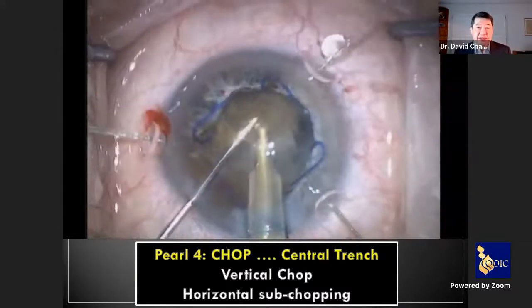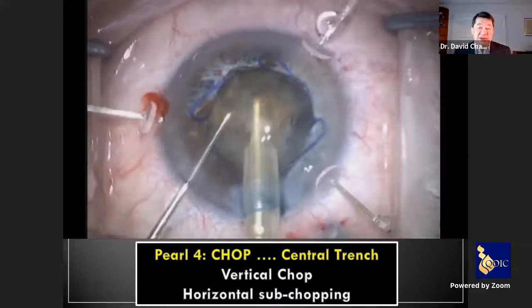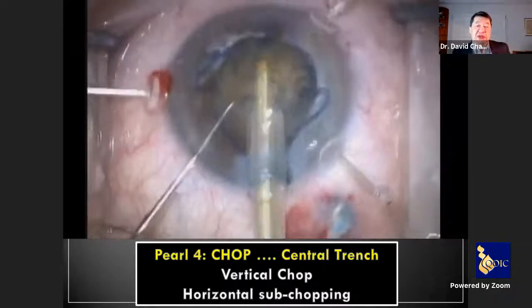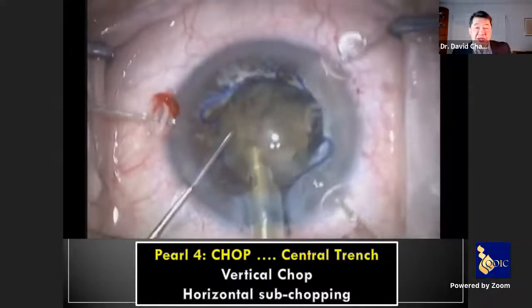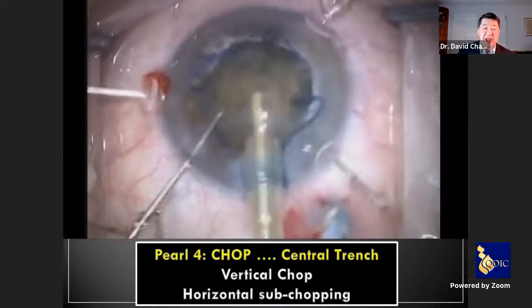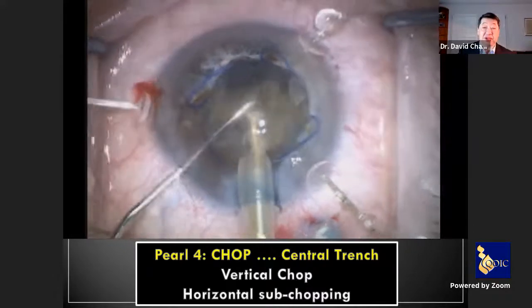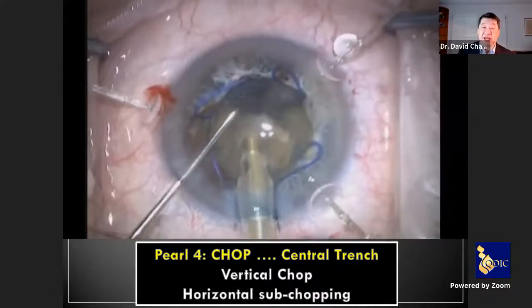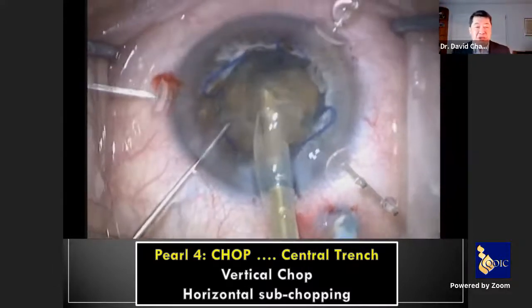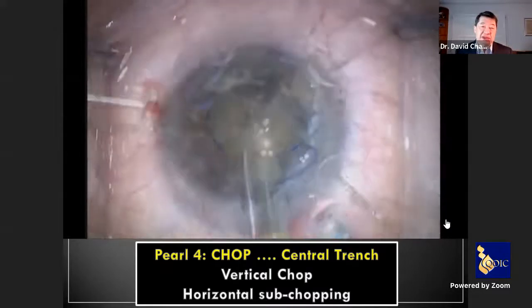And I'm incising the nucleus while at the same time I slightly lift the fragment with the phaco tip. And this creates this shearing motion that can, in this case, transmit all the way to the back of the lens. But the key is I did a half of a trench, just like I was sculpting, but I did not complete the trench. And once I rotated 180 degrees, it meant that I could get the phaco tip deep enough.